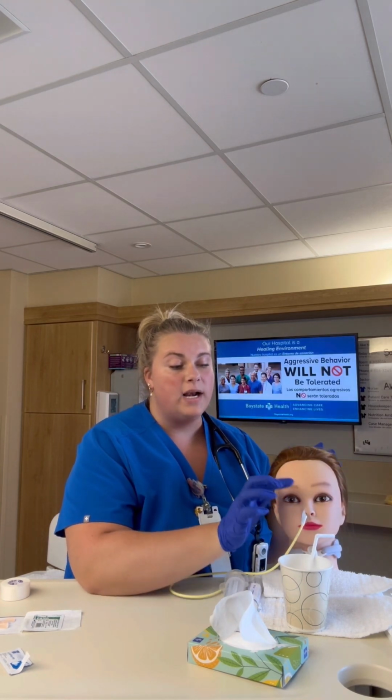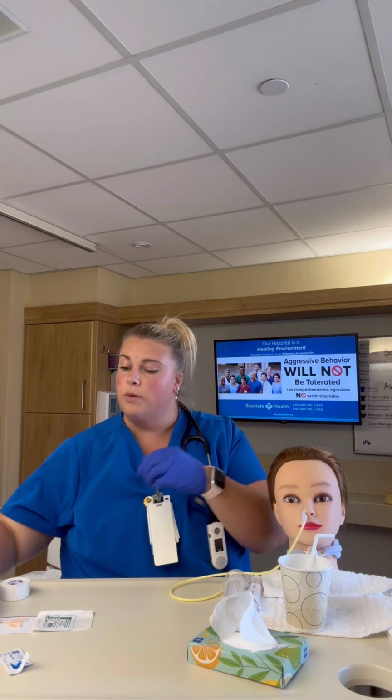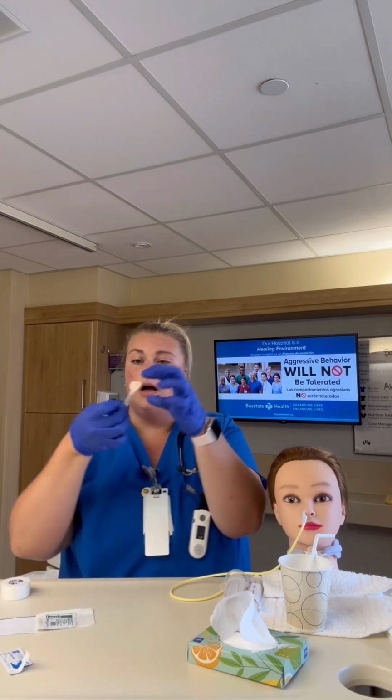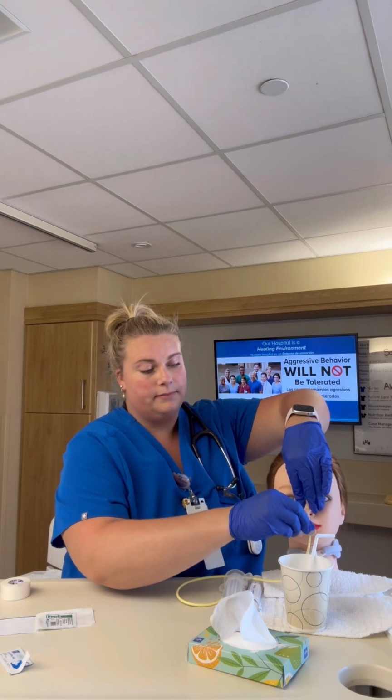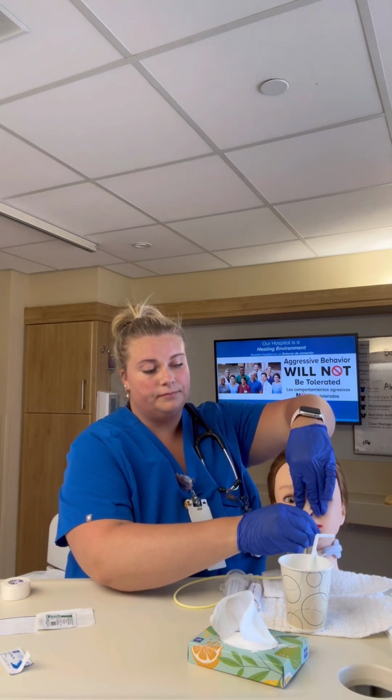From here, when I have reached that point, I am going to use my fastener on the nose to keep my tube in place. If I feel that it is not secure, I can also add more tape. So we have our NG tube inserted.